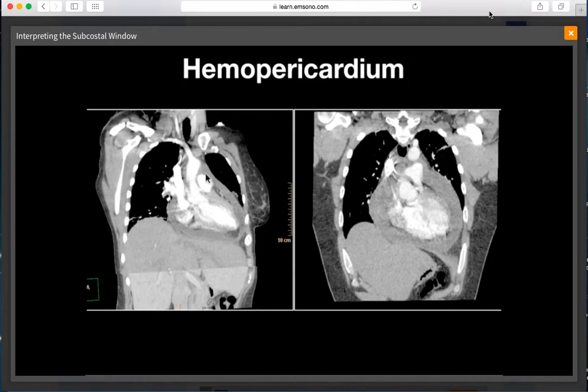Now using these CAT scans, you can see that the fluid collection here was a patient with a smaller pericardial fluid collection, but still it has to fit the shape of the container, and it basically here surrounds the heart. Here you have a patient with a much larger pericardial fluid collection, and again you can see that it's contained between the parietal and visceral layers of the pericardium, and it follows around the border of the heart.